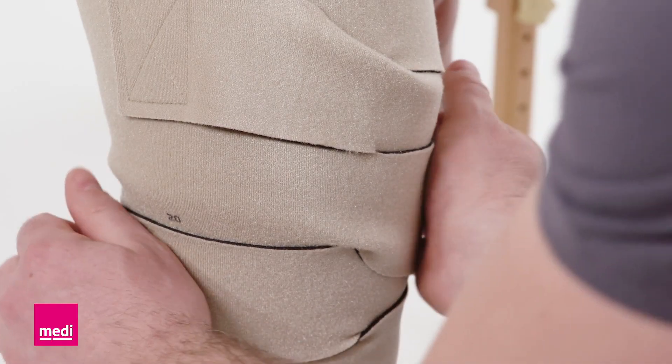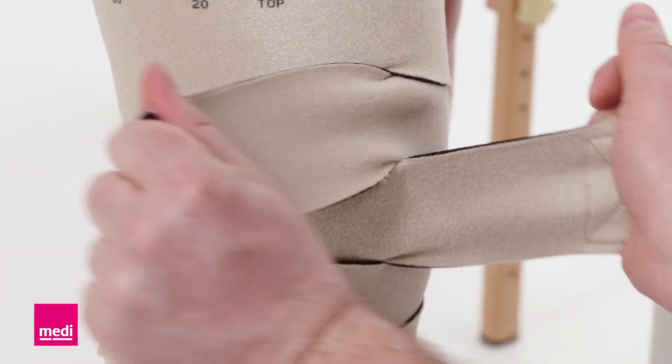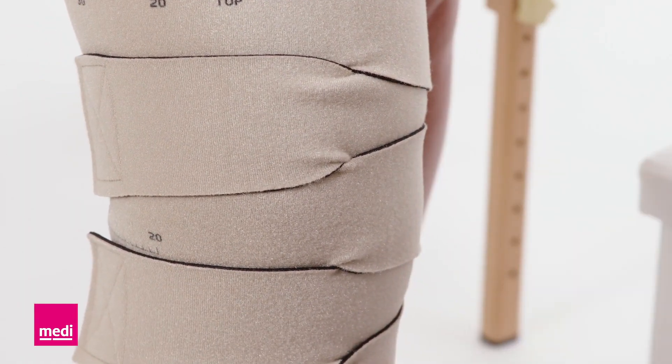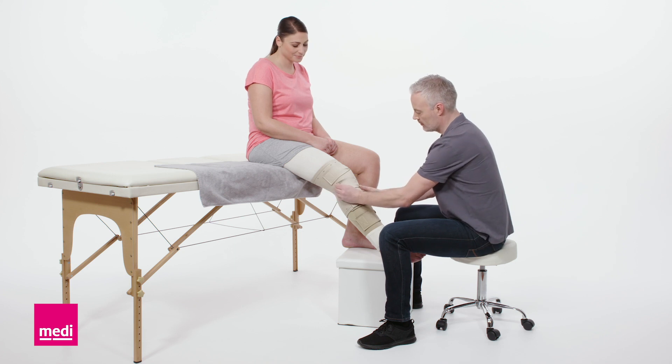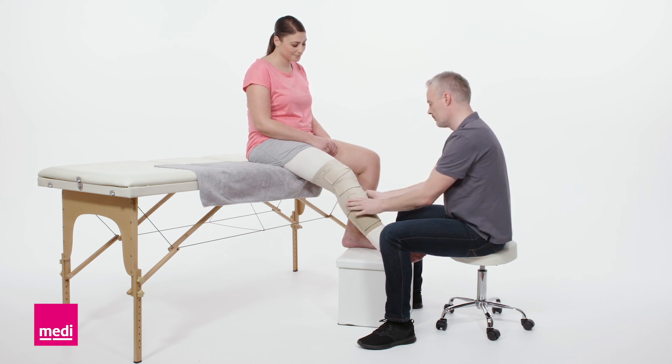If there are gaps or creases, simply readjust the bands. The bands should be tightened with firm and comfortable tension within the tolerance level of the patient. For effective therapy, you or your patient should readjust the compression throughout the day.